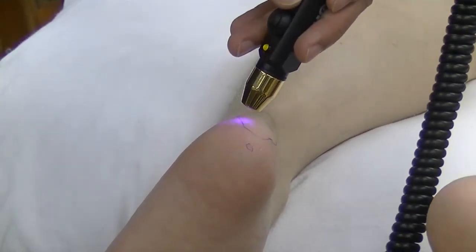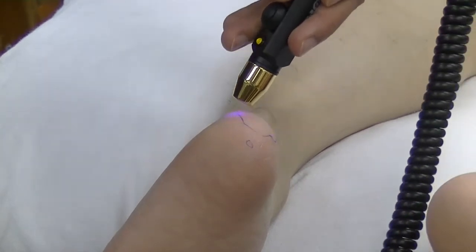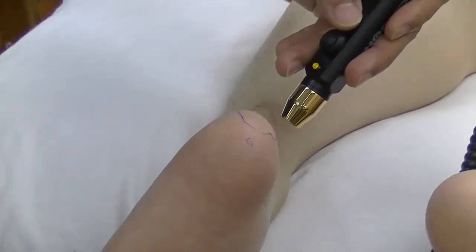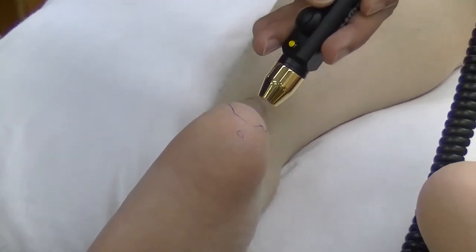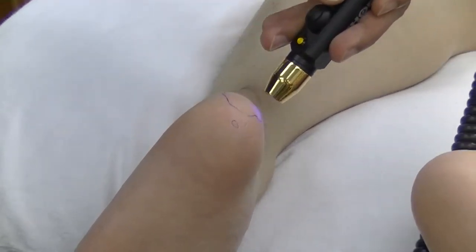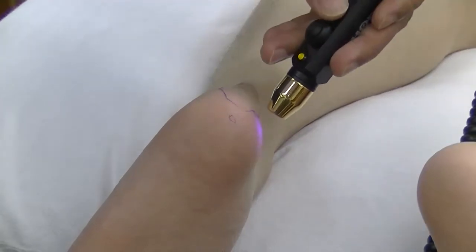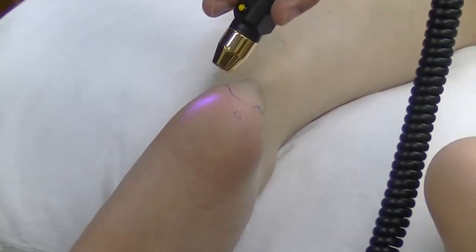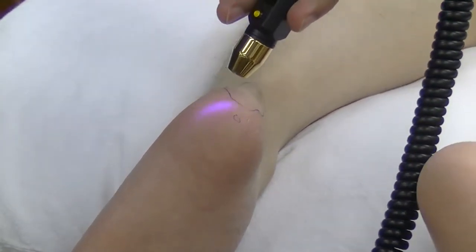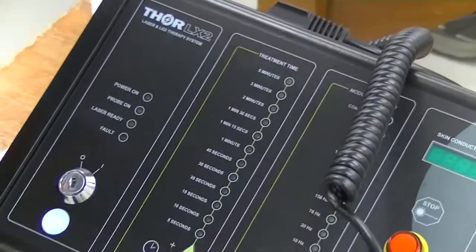We keep the probe perpendicular at all times as we move it across the wound. We check in with the patient — asking if they feel anything — and confirm there is no sensation, which is expected. The 30-second count is now complete and the treatment is finished.